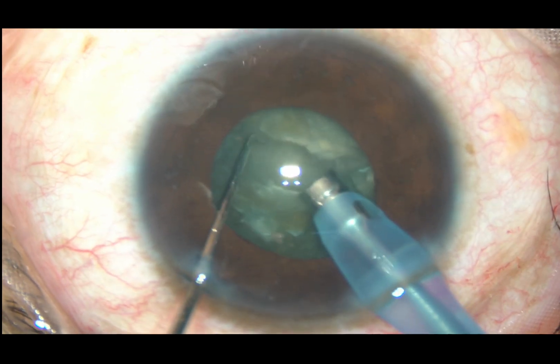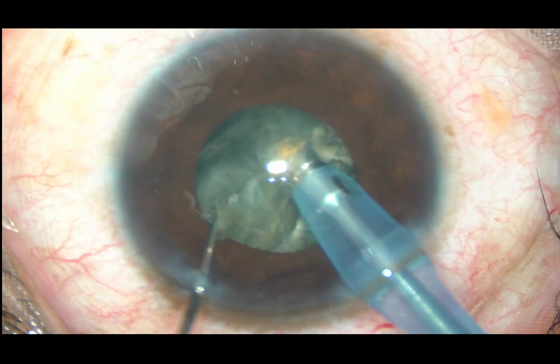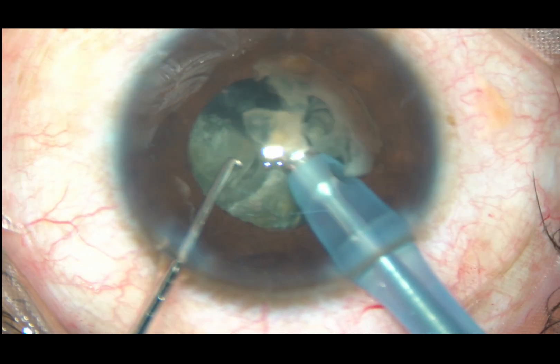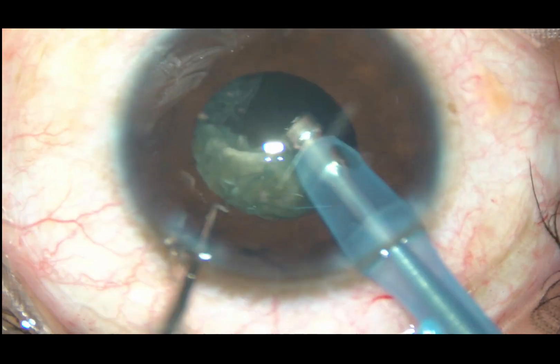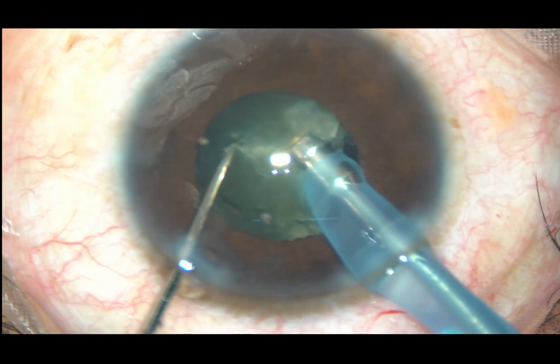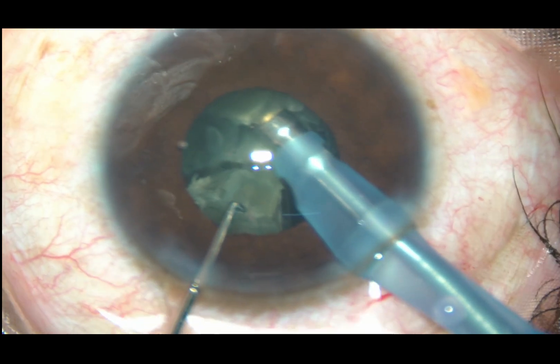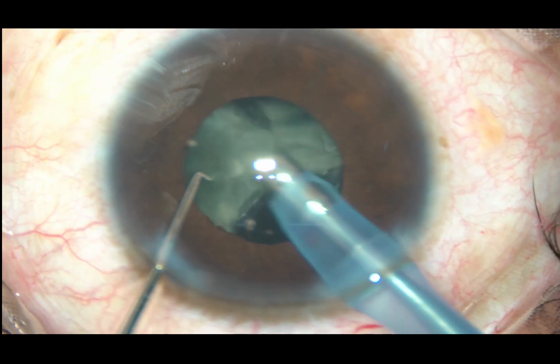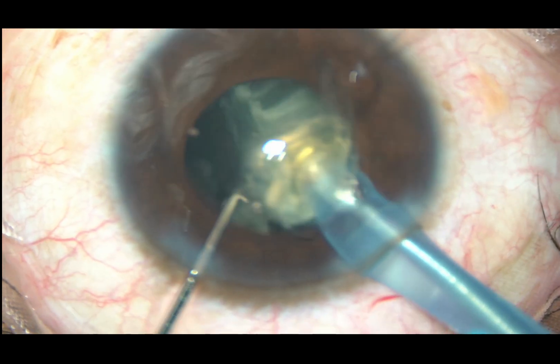Rotate it 180 degrees. Hold the lower hemi-nucleus and separate the two. Now each hemi-nucleus is further divided into two parts and each part is emulsified and taken out. Though the pupil is small, it is not floppy, so I am not troubled by this size of pupil. The pupil at this time is about four millimeters, so this is quite okay for management of the nucleus.